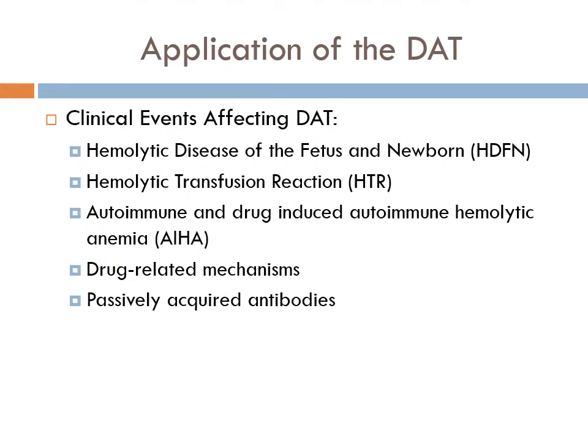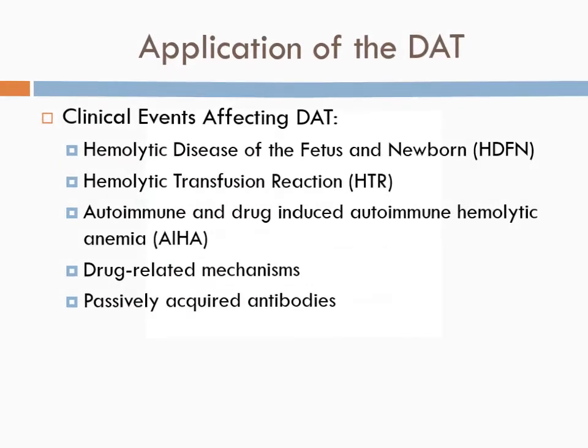So some applications of the DAT. Some clinical events affecting the DAT are hemolytic disease of the fetus and newborn, hemolytic transfusion reactions, autoimmune and drug-induced autoimmune hemolytic anemia, drug-related mechanisms, and passively acquired antibodies, such as the IVIG therapy.